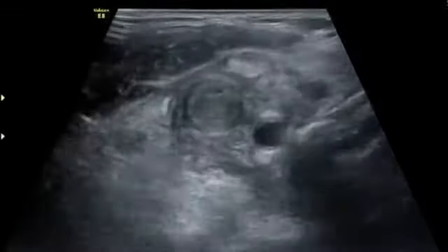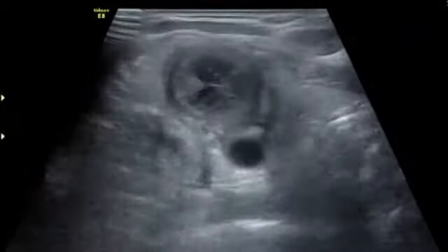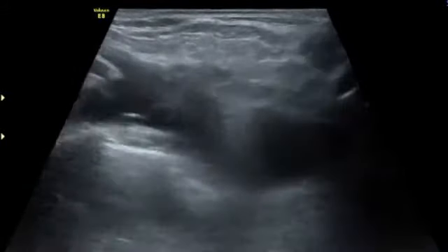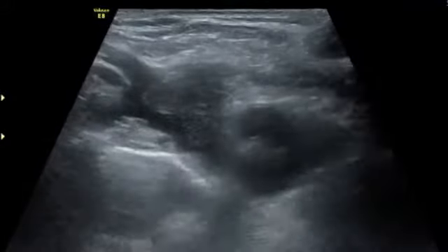Now here's the last case. This is a 40-year-old female who is on OCPs and had a twisting injury of the neck. She suddenly presented with a lump a few days after that injury. A video consultation was done with the ENT specialist and he asked for an ultrasound.